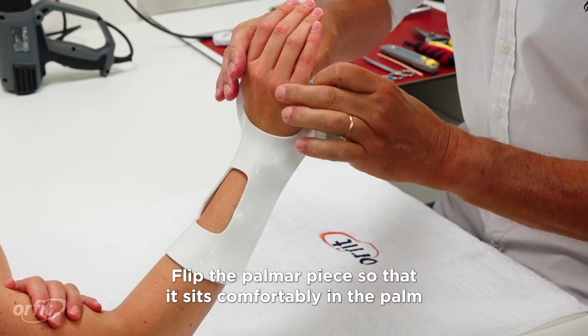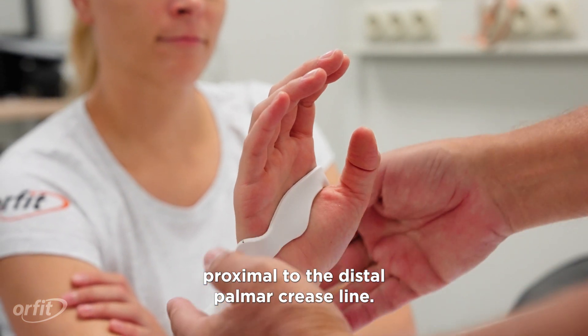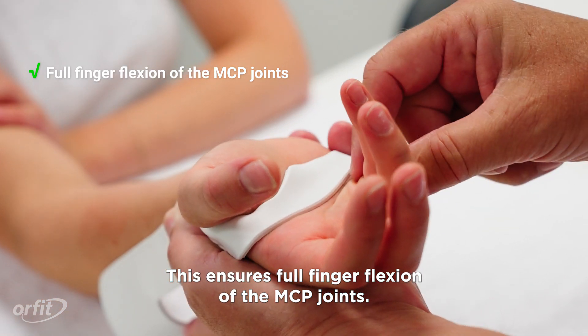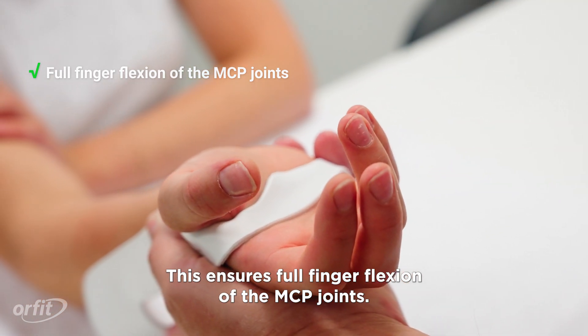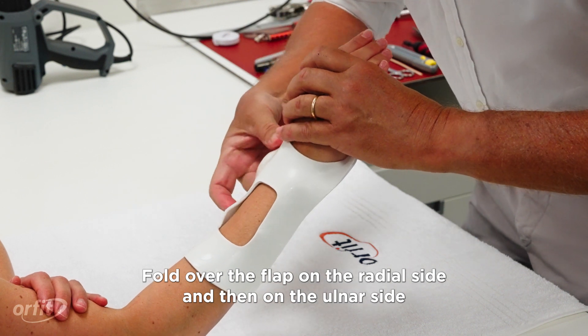Place the orthosis over the dorsal hand and slide it down on the dorsal aspect of the wrist and forearm. Flip the palmar piece so that it sits comfortably in the palm, proximal to the distal palmar crease line.